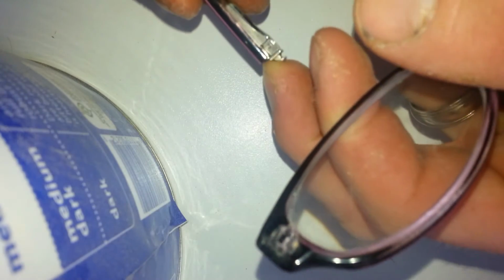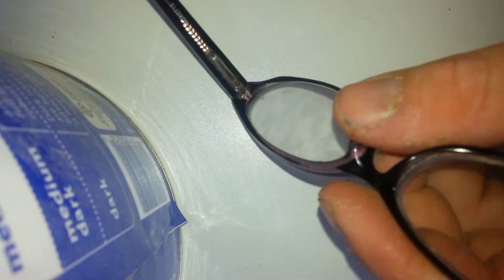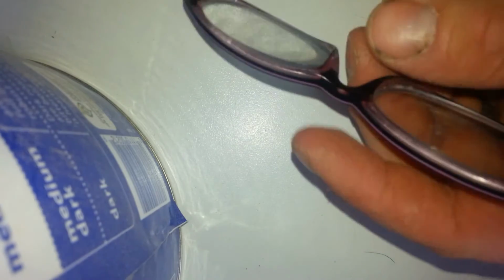Alright, so we have a situation where the hinge is still intact on the arm, as you can see here. It just slipped out of the joint.